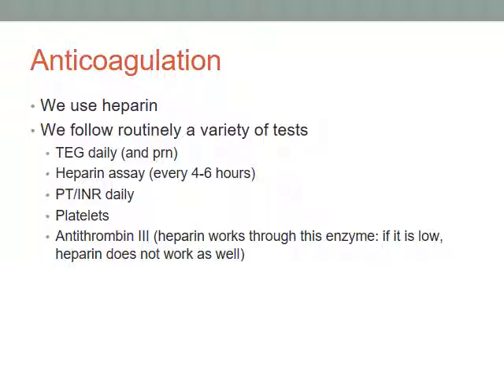Our 83-day run patient was an incredibly thrombogenic patient who went through, I think, 8 circuits. Some of the emergency circuit changes for thrombosis. We've never had a circuit thrombosis before. She clotted her pump a few times.